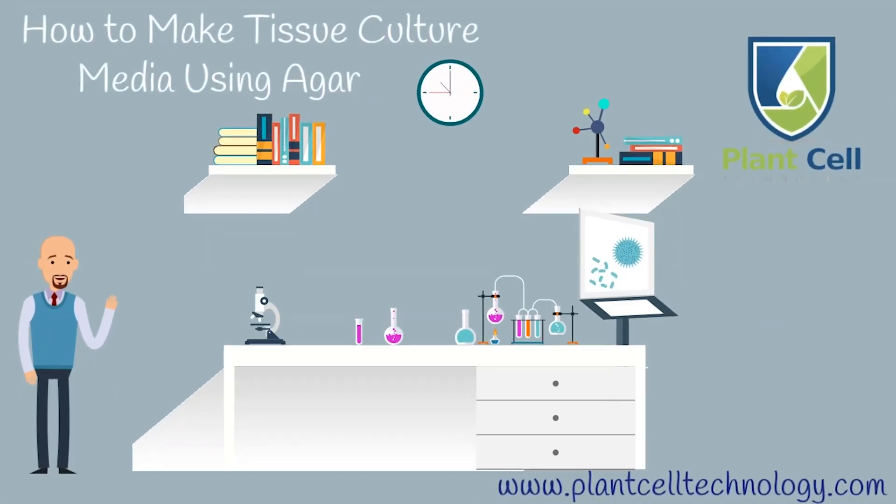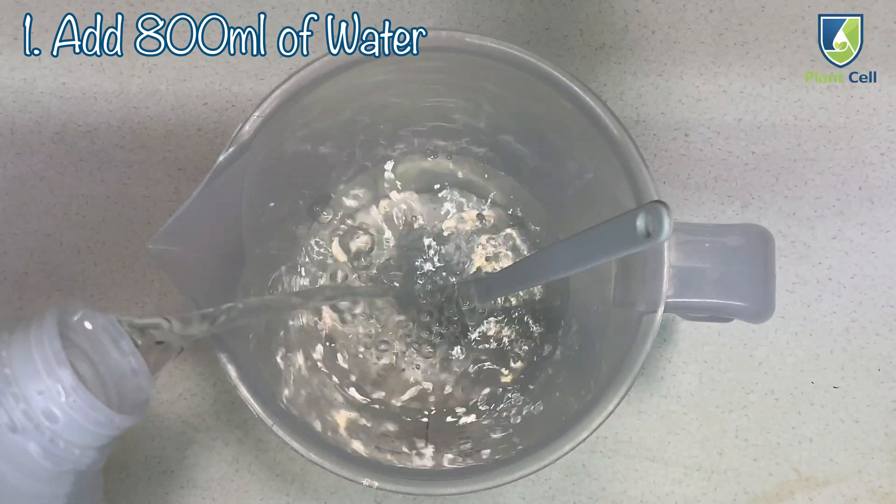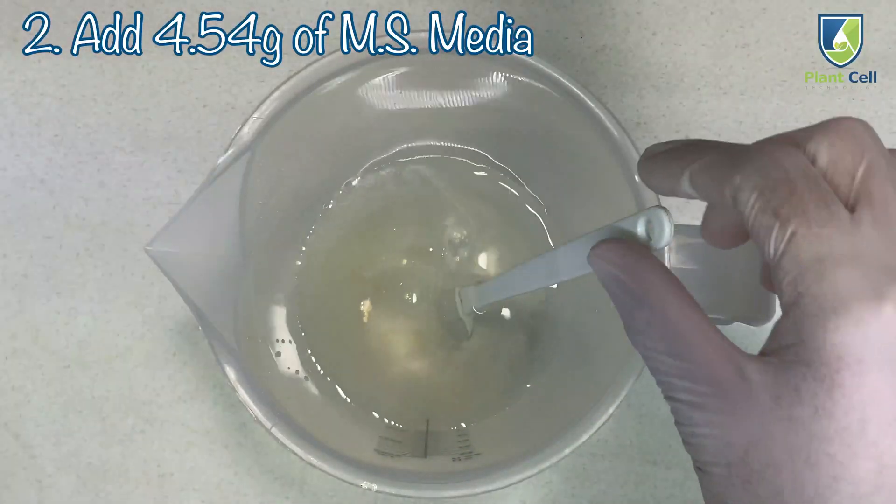Hey guys, welcome to how to make tissue culture media using agar. First, we add 800 milliliters of water. Second, add 4 grams of MS media.